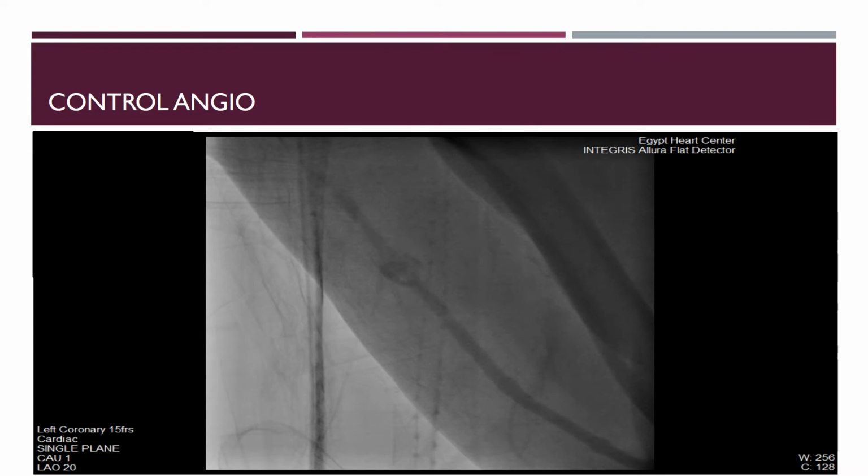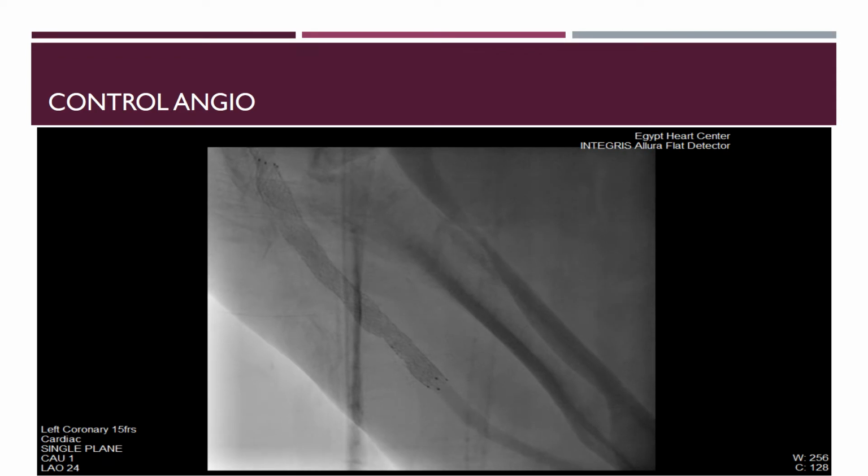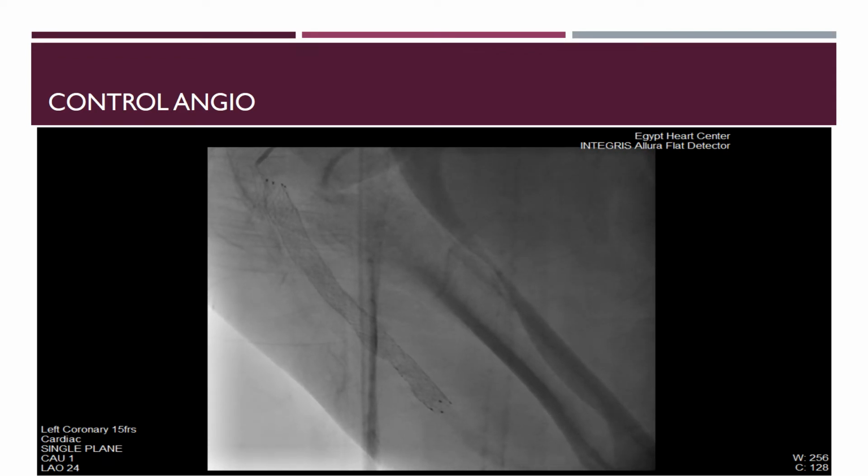This slide shows control fistulography of the mid-arm cephalic vein lesion after 3 balloon dilatations, still exhibiting recoil and, at the same time, no thrill was palpable. Stenting and post-dilatation of the mid-arm cephalic vein lesion could correct the recoil and was accompanied by instant palpation of fistula thrill.